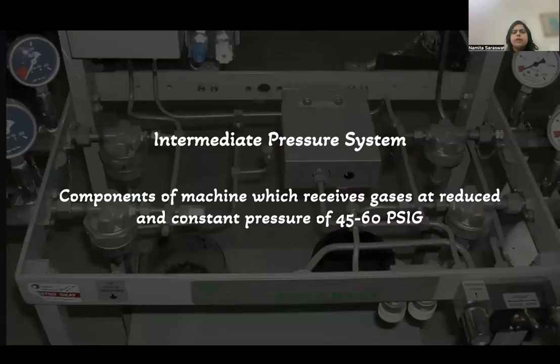Now moving on to the intermediate pressure system. The components of the machine which receive gases at a reduced and constant pressure of 45 to 60 psi come in the intermediate pressure system. The intermediate pressure system arises from the pressure regulator, and it ends at the flow control knobs.